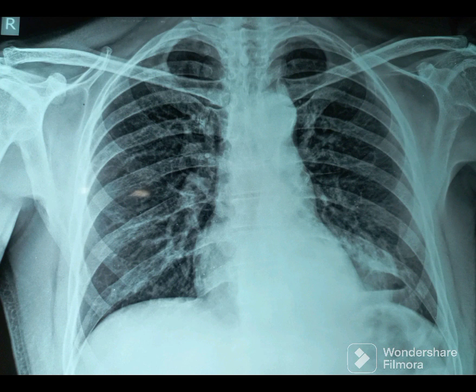The displayed chest X-ray looks almost normal except for a small straight line at the left base. Perfect straight lines in a chest X-ray are always abnormal and indicate an air-fluid interface.